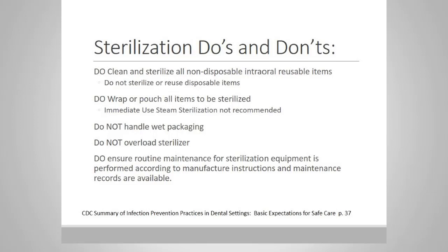If you have a wet instrument package that comes out of the autoclave, you should not be handling it. The moisture in the packaging acts as a wick and absorbs any type of microorganisms that might be on your hand, and that will compromise the sterility.